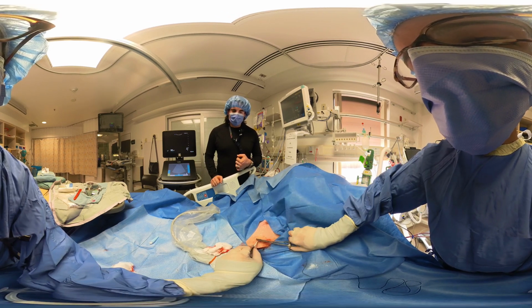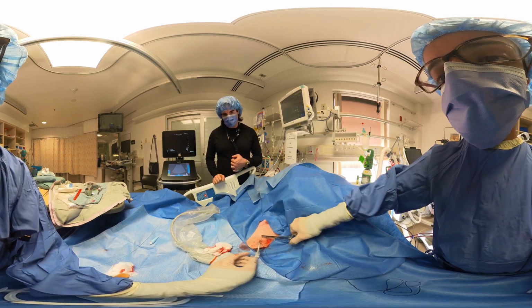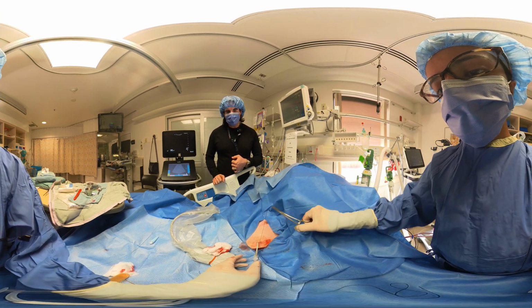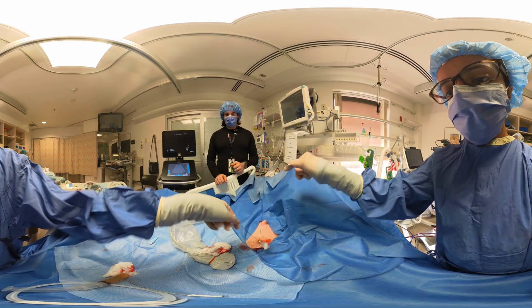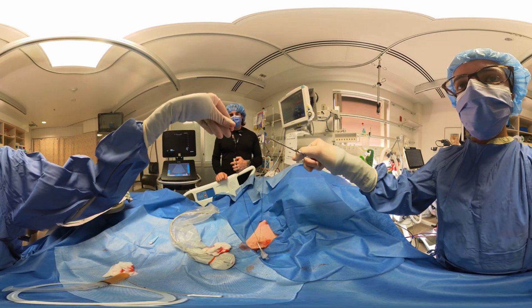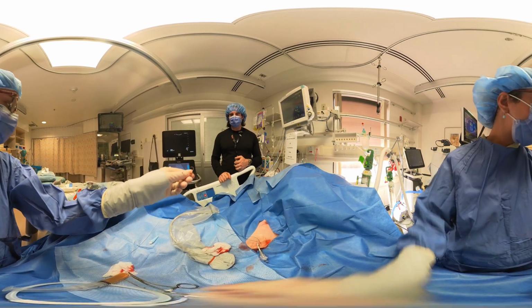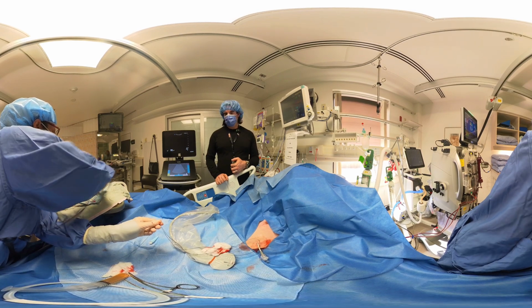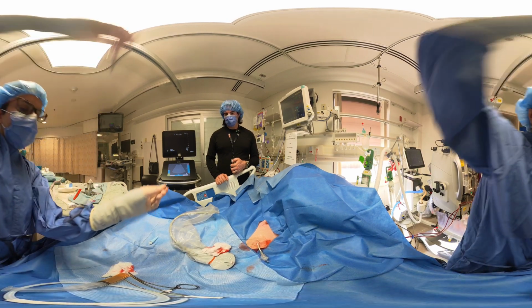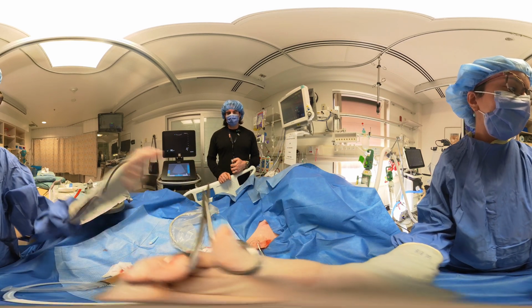Yeah, okay. Now what we're going to do here, once you pull through the needle, go ahead, keep pulling it through, yeah. Okay, we're going to make the tails even. Okay, yeah. We can actually cut off the needle now, so we don't need the needle anymore. So we can cut it off. It just makes you less likely to stick yourself. Perfect. Okay, so we've cut off the needle.